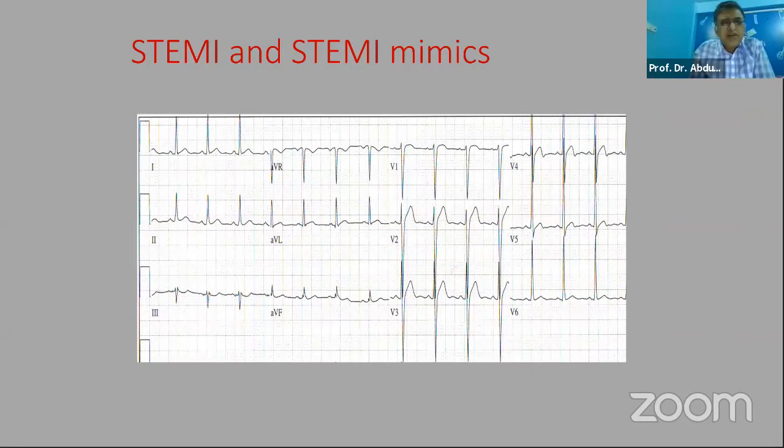His QT duration is a little bit smallish, isn't it? Since it was mentioned, one of the fellows was doing a question. A patient came in with rhabdomyolysis, dehydration, and then renal failure, and then they gave an EKG. So I told them to look for either QT prolonged or QT shortened. QT shortened could be hypercalcemia. But it's interesting to look for.